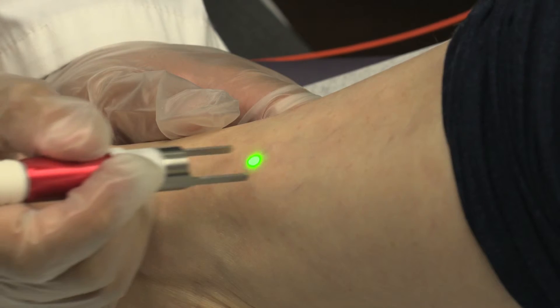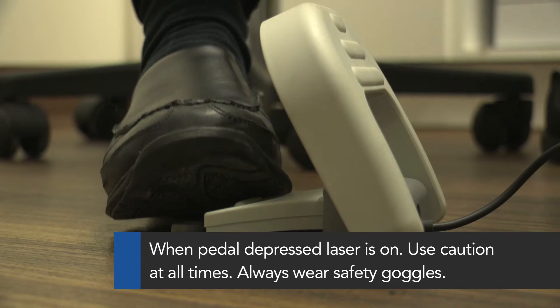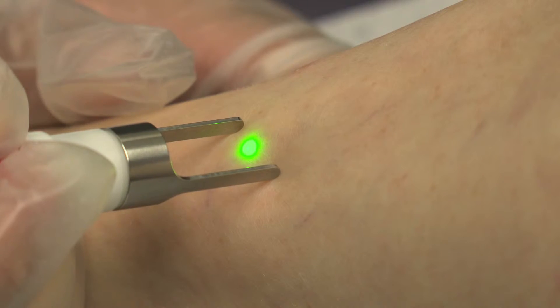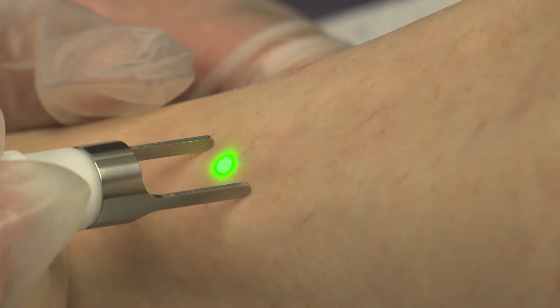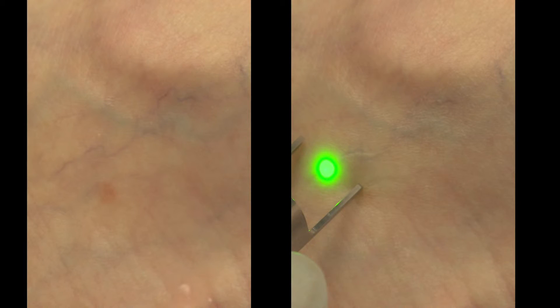Aim the laser directly above the surface. Depress the foot pedal to turn the laser on. Slowly follow the vessel path with the beam, ensuring that the laser beam spot covers the entire width of the target vessel. The colour of the vessel will change to a shade of grey when the treatment is performed successfully.